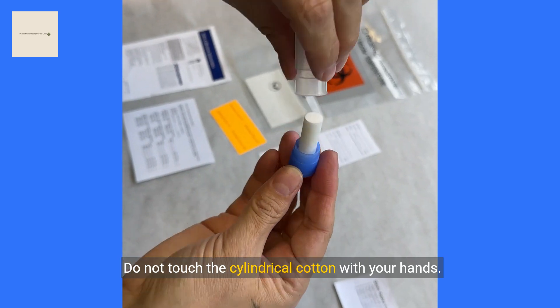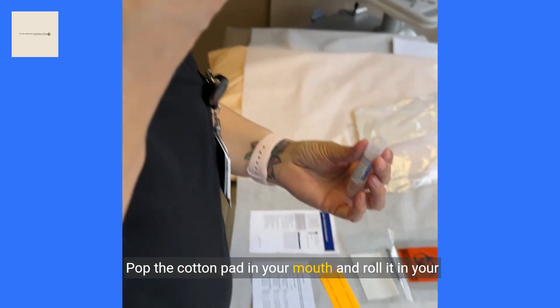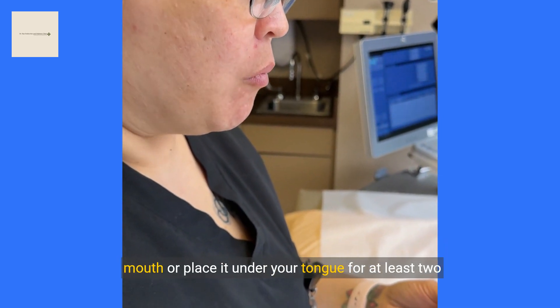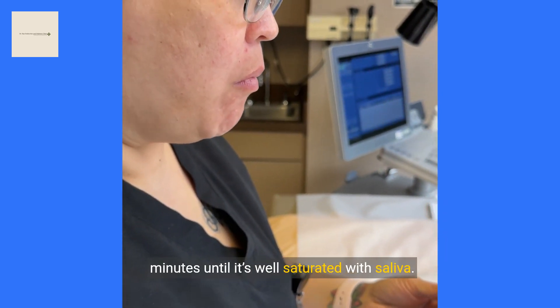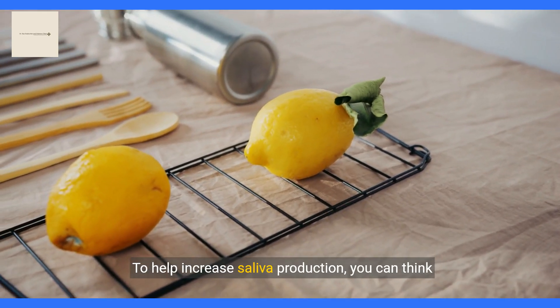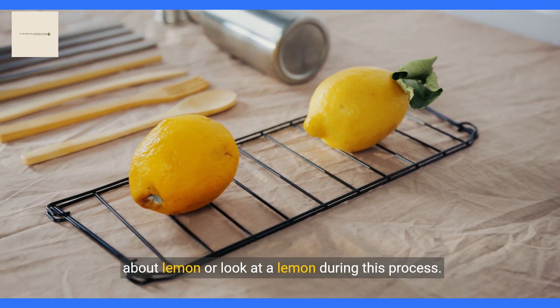Do not touch the cylindrical cotton pad with your hands. Place the cotton pad in your mouth and roll it around, or place it under your tongue for at least 2 minutes until it's well saturated with saliva. To help increase saliva production, you can think about a lemon or look at a lemon during this process.